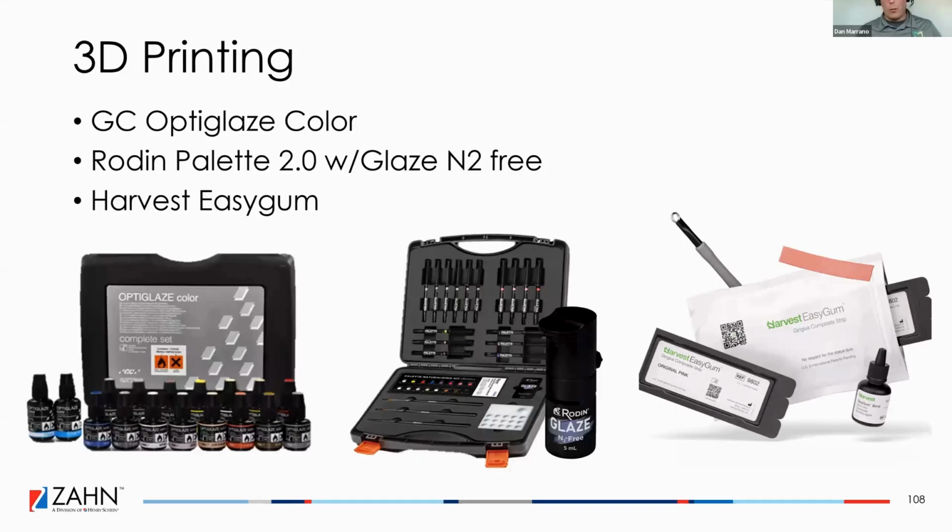Finishing them, you have a wide range of materials. It depends on how long you want it to last. A lot of the offices are using OptiGlaze Color right now because they're just painting some red or pink on there and then putting it in the patient's mouth because they're on a time crunch. When we go to more longer-term temporaries or provisionals, maybe we're using the Easy Gum to know that it'll last. We're not going to brush it off or something like that. And we've been using some of the N2 free glaze from Rodin that works very nice as well.